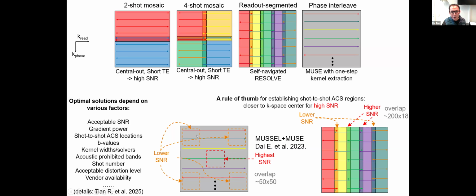And you don't need to care about the low SNR regions in the peripheral K-space. But in the original LORAKS, maybe they have to deal with these K-space inconsistencies because in their case they are locally correcting the K-space inconsistency. But we assume this K-space filter is the same everywhere. So the best place to get the phase information is the center.